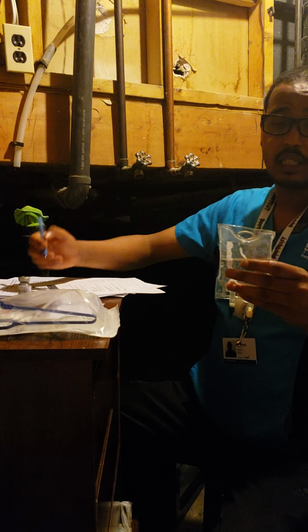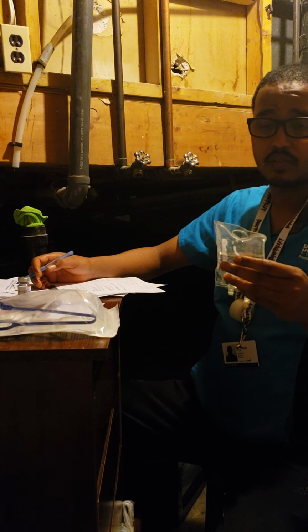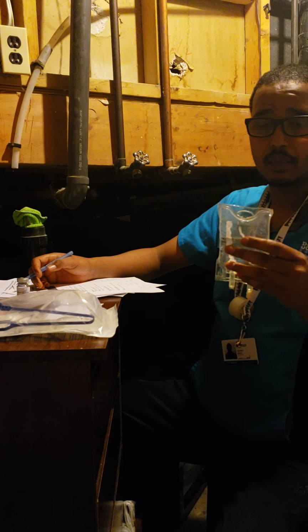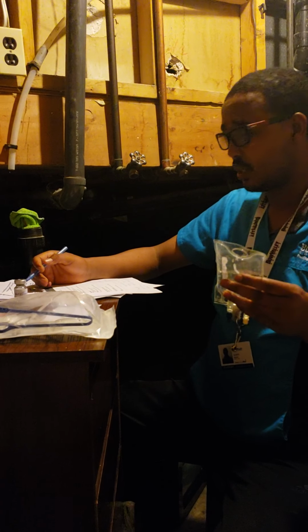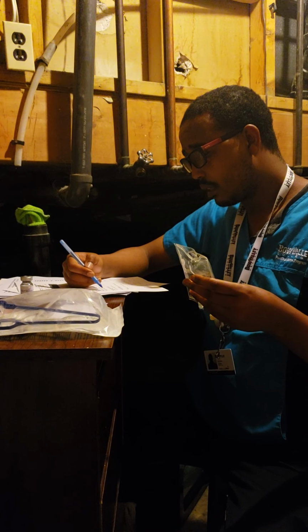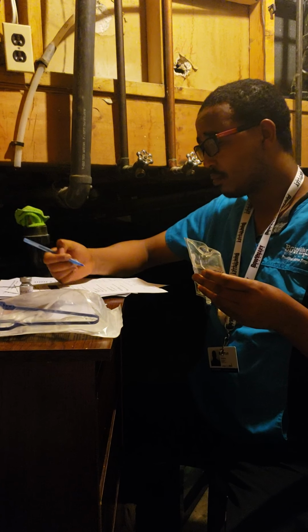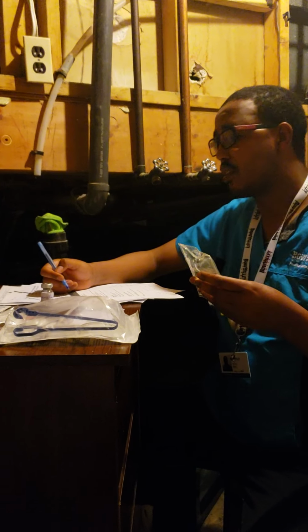My third check: this is 0.9% sodium chloride, it is 50 ml, and the expiry date is January 21st, and this is the mini bag solution, and I'm going to use it for medication dilution. From the monograph I have to dilute it in normal saline, and the amount is 50 to 100 ml mini bag infused over 20 to 30 minutes, and the reason is I have to use it for intermittent IV infusion. So I have done my 3 checks.